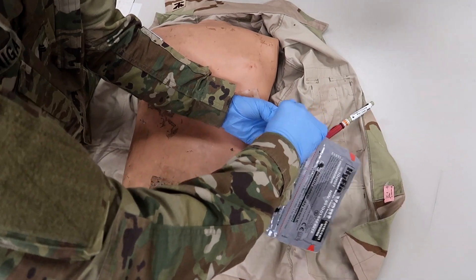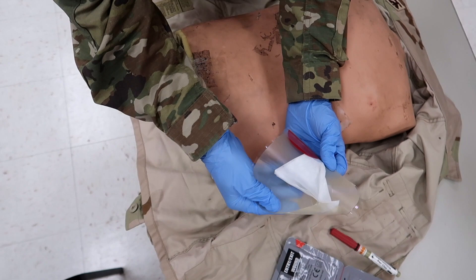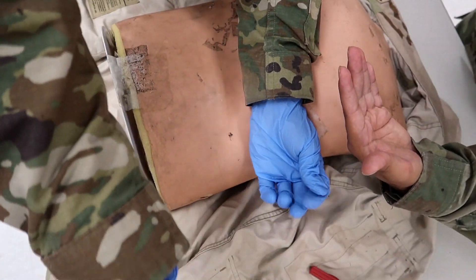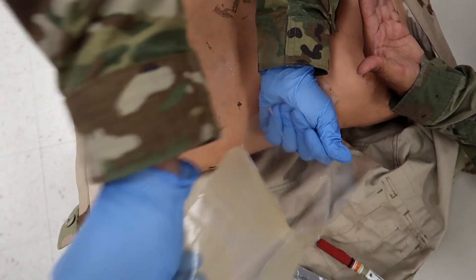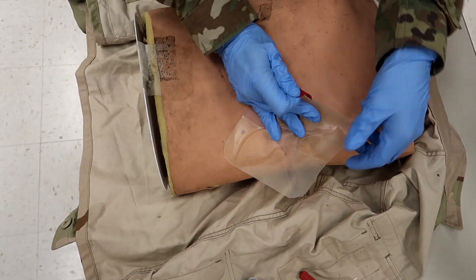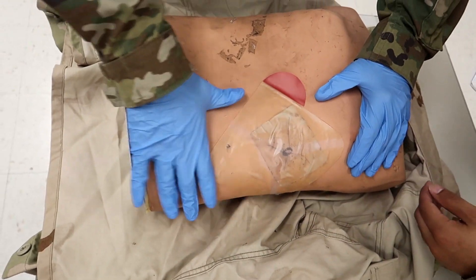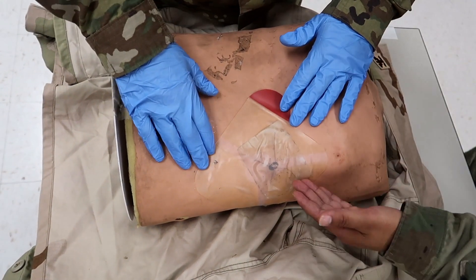Upon full expiration — meaning when the patient exhales — you cover the wound with a large occlusive dressing. You cover the first wound you encounter. A tip: the reason the back of his hand is there is because the glove is non-porous, applying a seal in the meantime while he preps his equipment. He exhales, places it on there, and you want to make sure the seal extends at least two inches on each side.